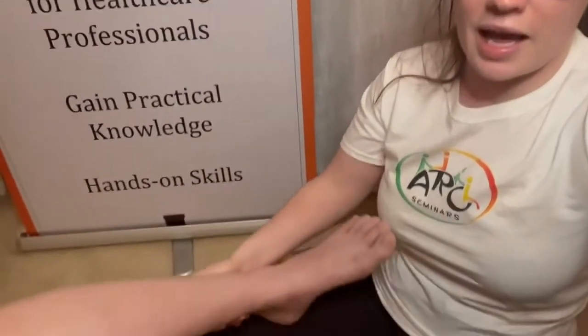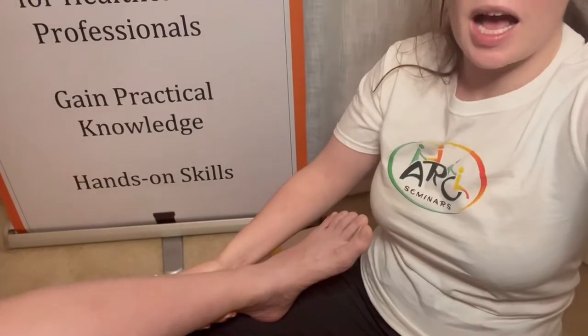And now I'm going to show you how to do compression bandaging or toe bandaging for the toes. This is something you may want to do with your patients who have swelling in the toes, fungal infections in the toes, or things of that nature where you really want to separate the skin of the toes to get your best result. So here I have a foot for demonstration and we're going to get into it.